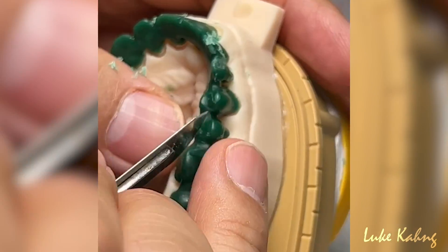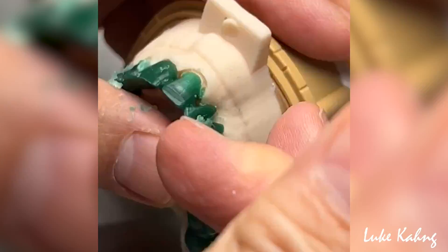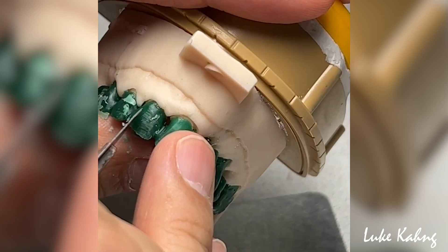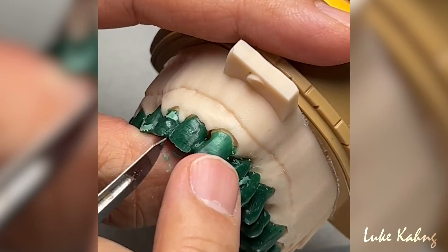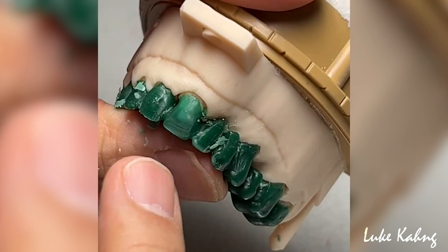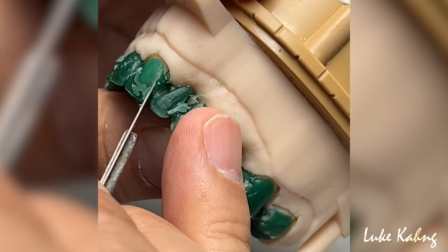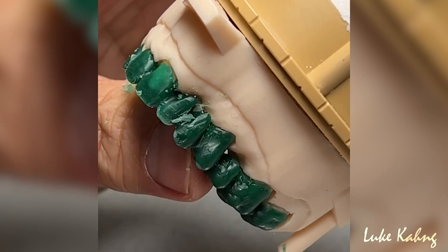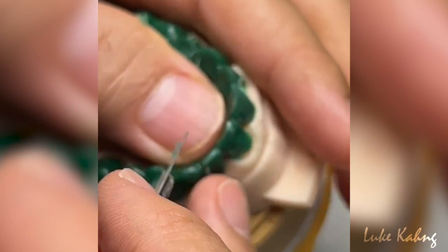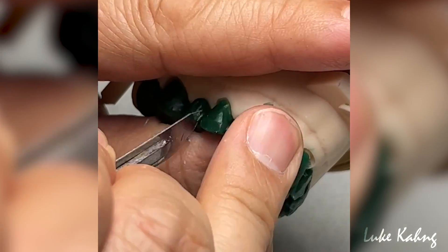Let's see, everything's okay. I'm trying to bring it in. Right, the same size. Okay, now you can move to the next one. The K9 is too tall — a little bit of grinding. That's the same now.